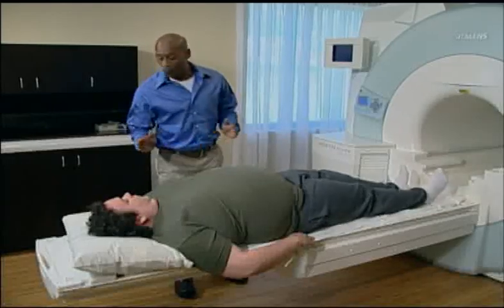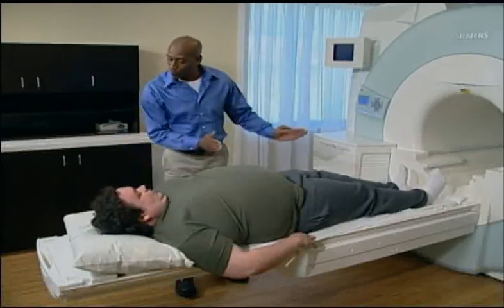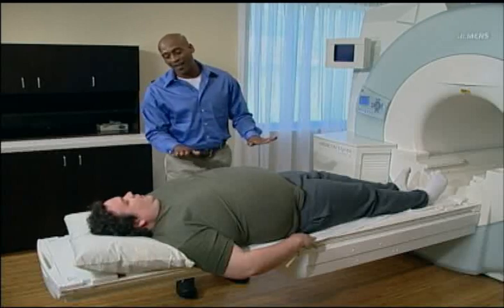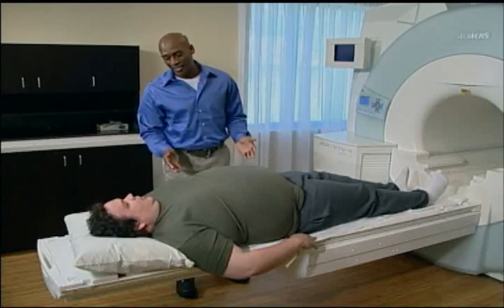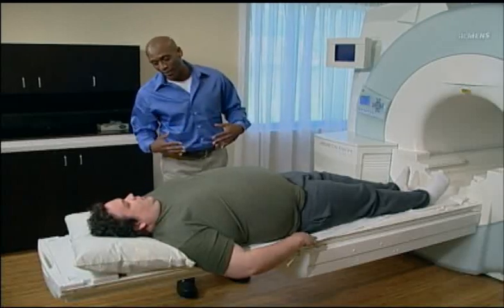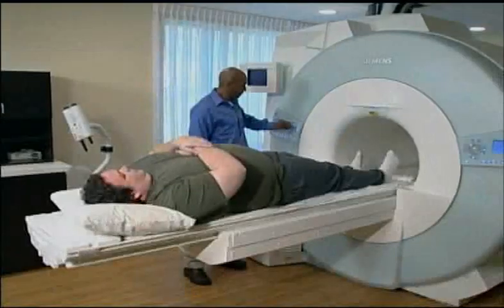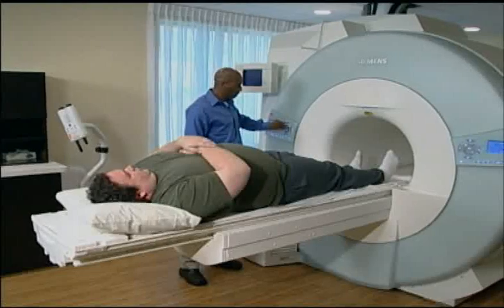It's important to point out that MRI utilizes magnetic fields and radio waves. Patients are not exposed to x-rays or other ionizing radiation.